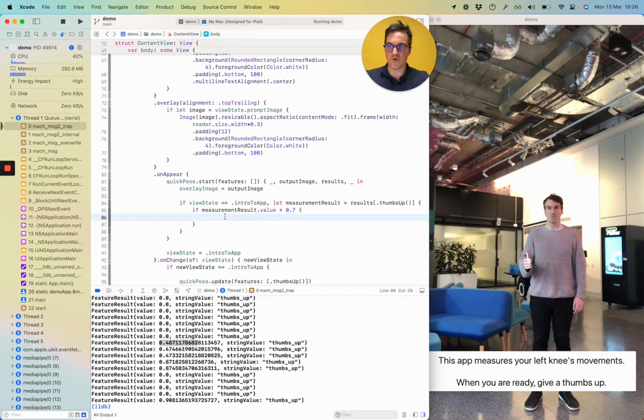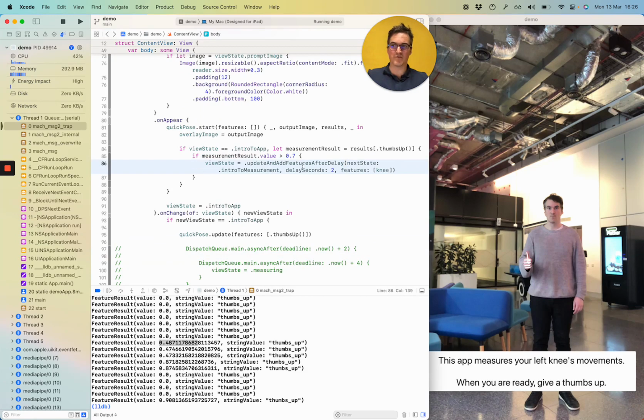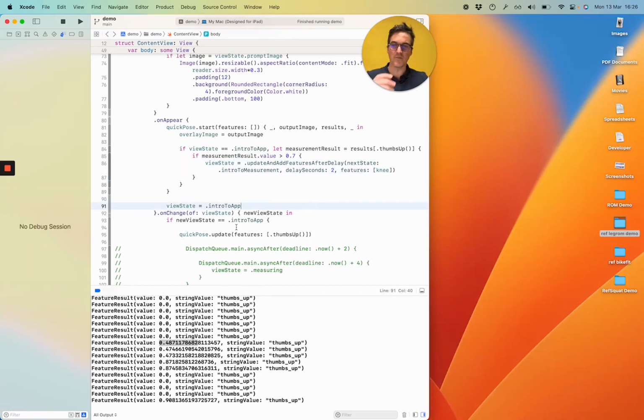Okay, so when I have a measurement value of higher than 0.7, this is where I can bring in my view state change. So let's bring that in. So I change the view state, and I want it to change to intro to measurement. And then I want to show my knee after that. Let's see how that works.